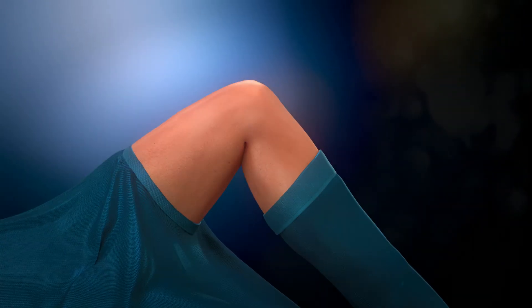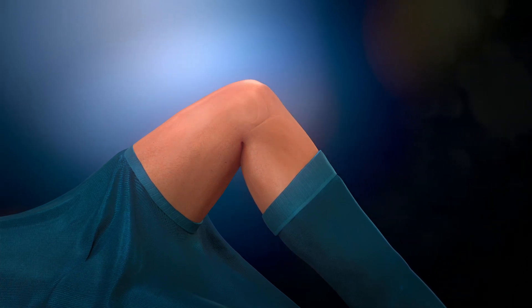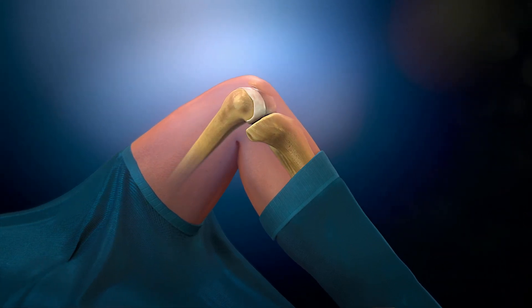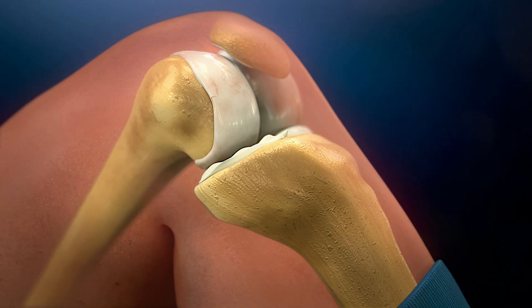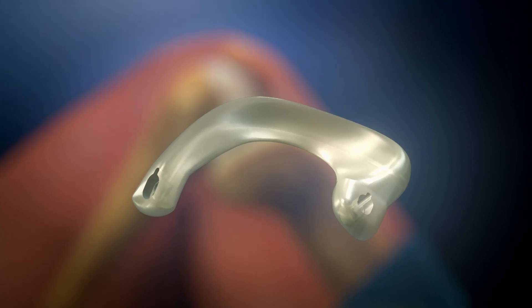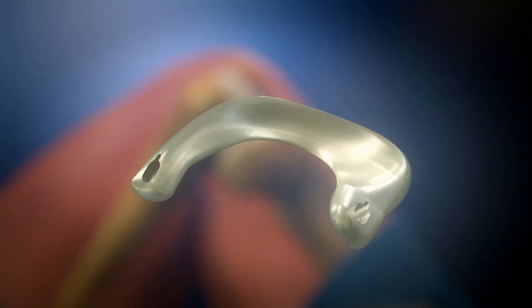Meniscus injury can be severely debilitating and may lead to osteoarthritis and the need for knee arthroplasty. Today's treatment options are very limited, resulting in a high unmet need. Patients with a history of resection of the knee joint meniscus can get help with pain relief through the Trampolin meniscus prosthesis developed by Atro Medical.